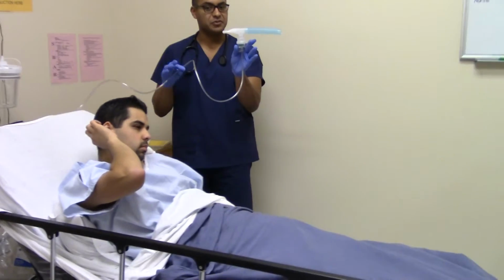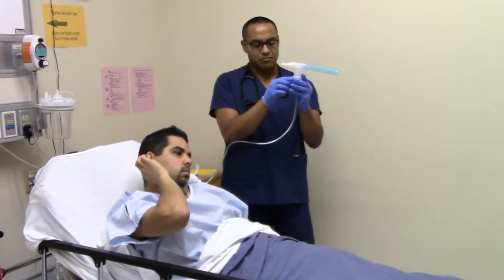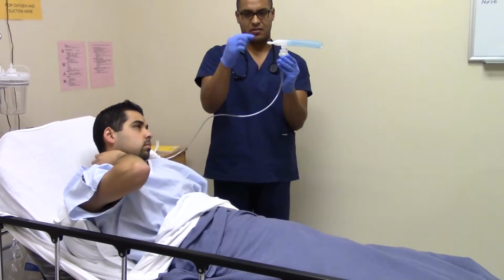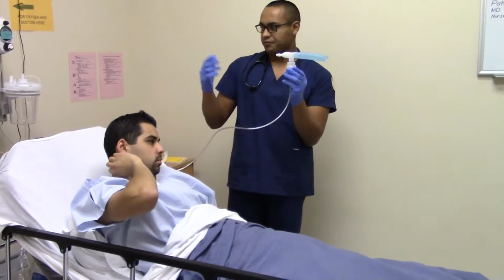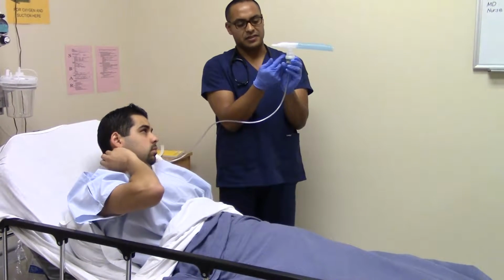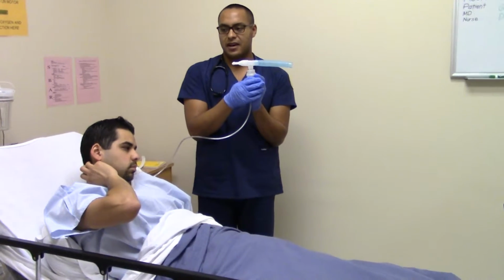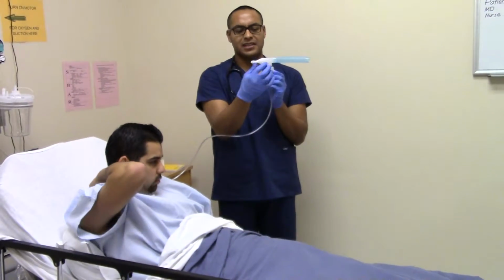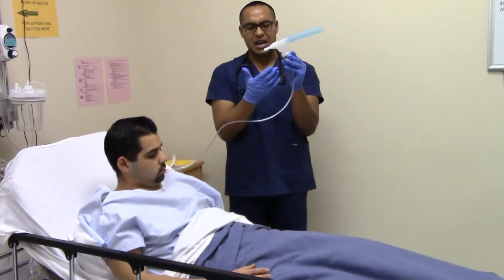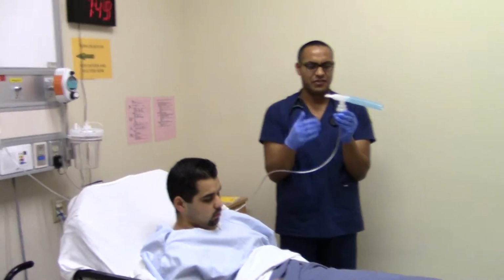Before I give it to him, I'll explain to you what I should tell you. The medication goes in here. You open it and put it in there, okay? But you'll see gas coming out. Aerosol-wise, there's a baffle in here that breaks up the liquid, making it into a gas, and it creates a gas in the reservoir here. Tilting it by the patient would decrease the flow of the aerosol gas, so that kind of defeats the purpose.